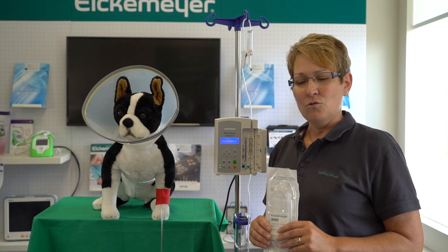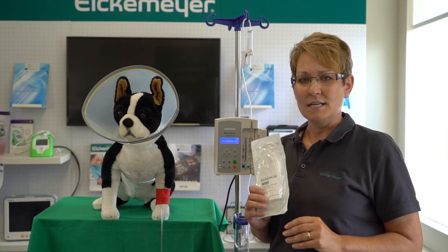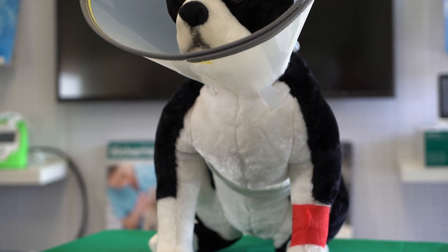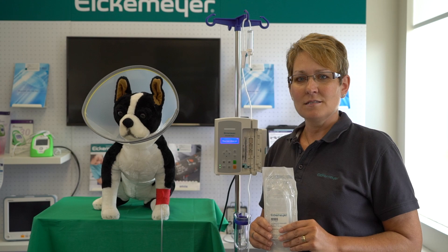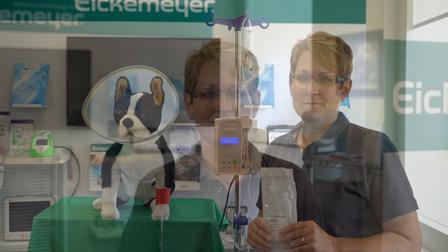This unit offers its own calibrated IV lines and extension sets that are DEHP and latex-free. Both are competitively priced and are available through your buying groups. For more information on this or any of our products, please give us a call at the office or online.